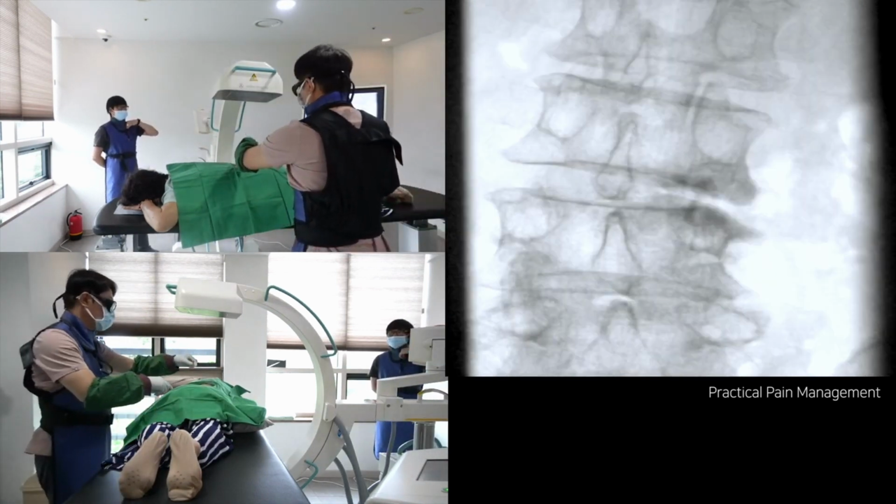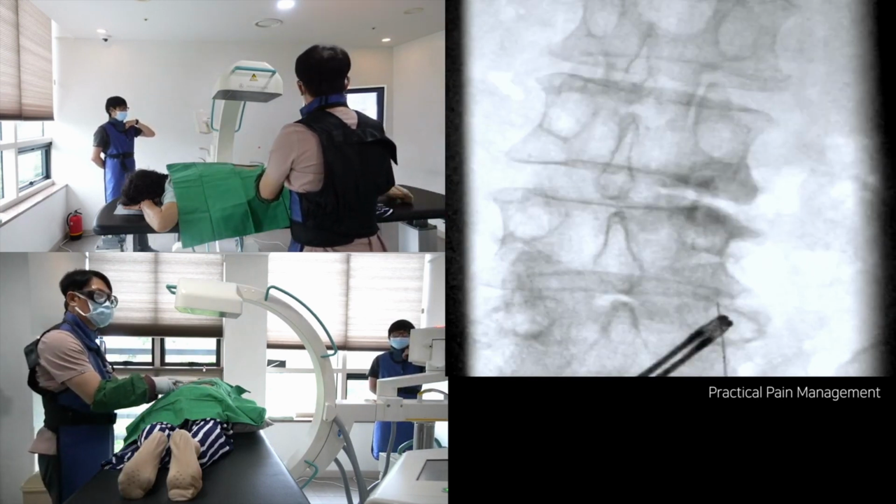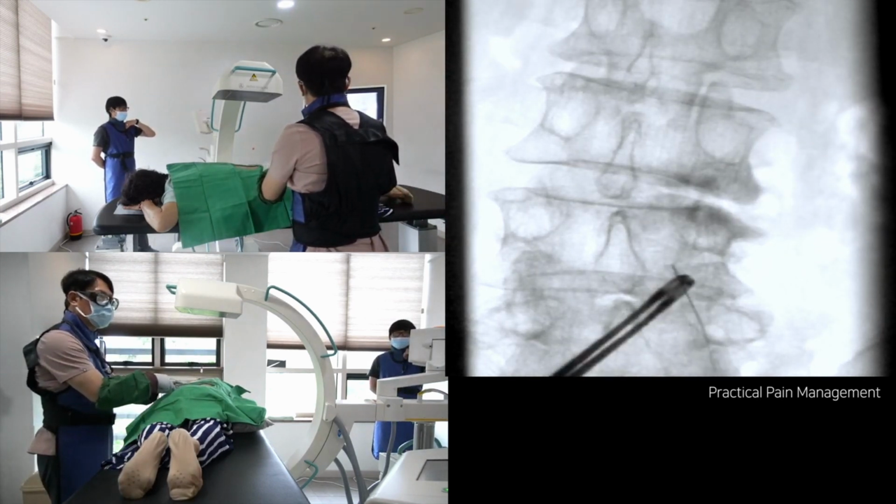In cases of severe foraminal stenosis, I often substitute a transforaminal injection with a facet joint injection. This reduces the chance of post-injection soreness or radicular pain associated with an intensive transforaminal approach. There are several advantages to facet joint injections in such cases: reduced chance of post-injection radicular pain, longer steroid retention in the target, and a larger reservoir of medicine in the foraminal space.